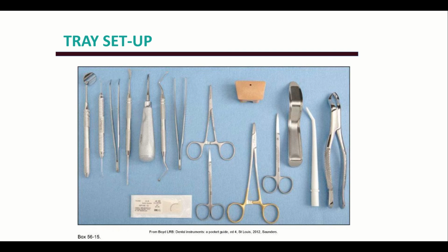So this is what your tray might look like when you are setting up for this procedure. Here's your instruments, and we're going to go through some of these instruments individually in a second. Notice that we have a basic setup. Basic setup goes with every setup of instruments. And then we're going to talk about these in just a second.